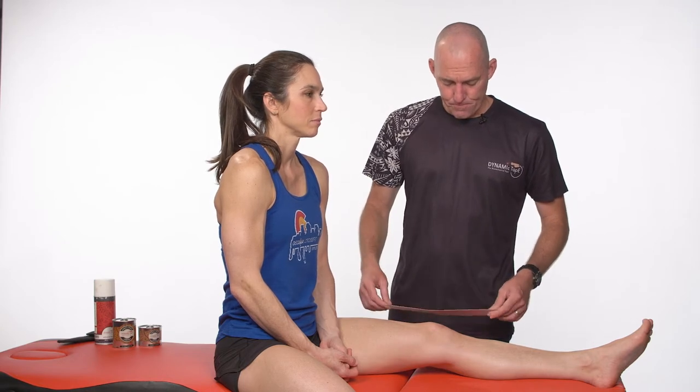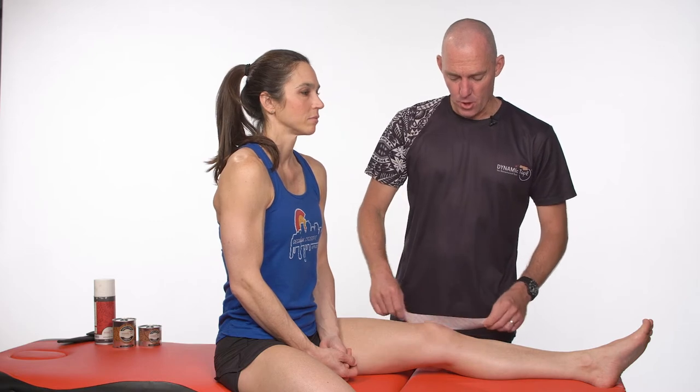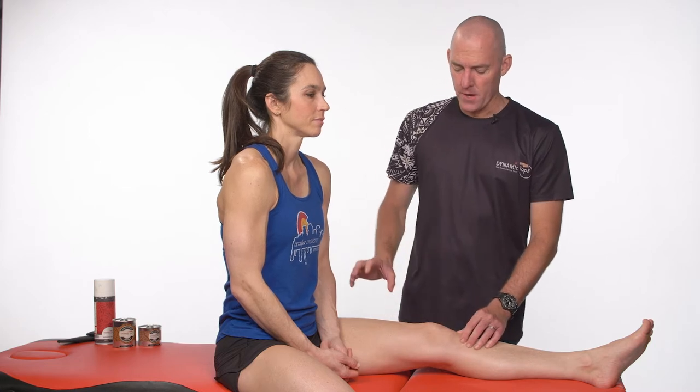This is a patellofemoral sling technique, similar to the patellofemoral loop technique, but using five centimeter or two inch tape in separate pieces. The idea is that if we find a medially directed force is beneficial or pain relieving — perhaps when somebody squats down or steps up — we can apply that force with tape to build up capacity, reduce pain, and reduce pain inhibition as we go along.